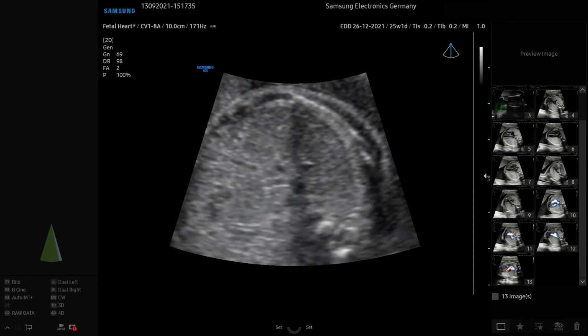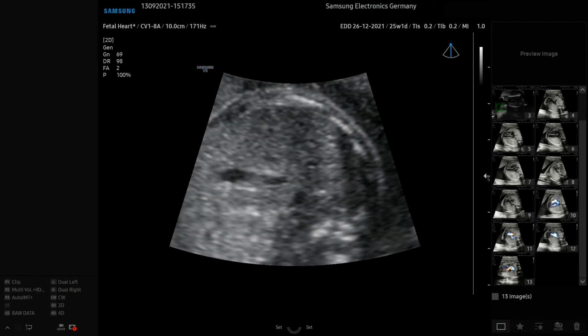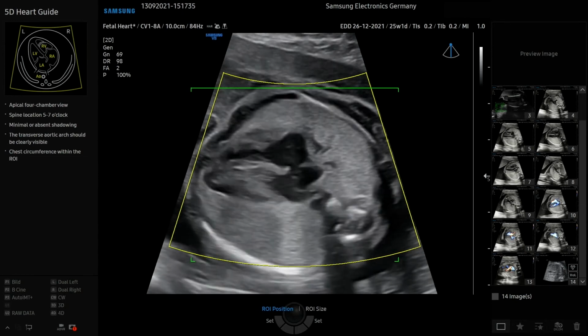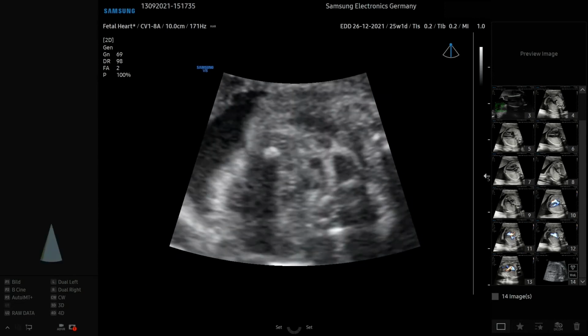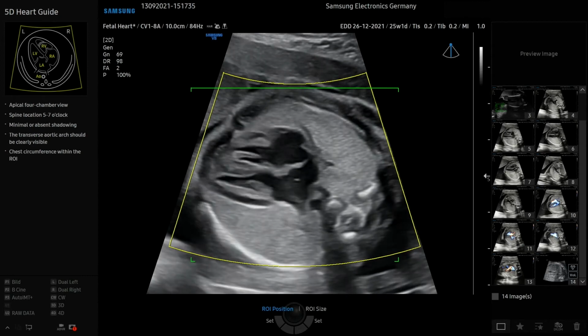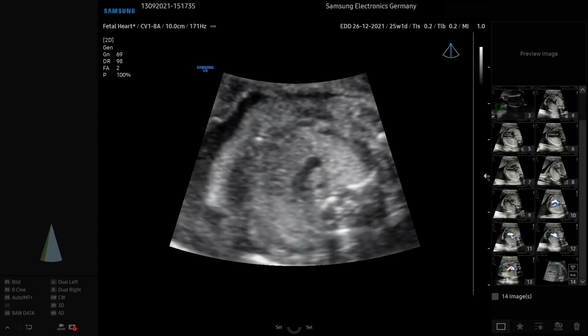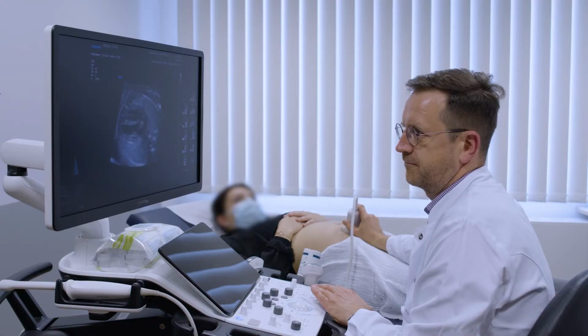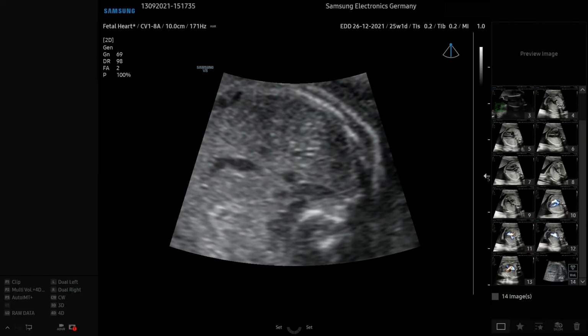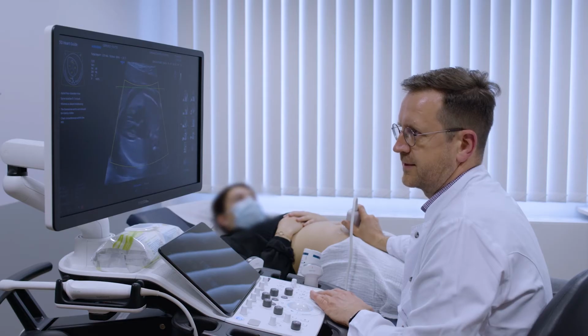The baby is a little bit moving. I save the volume, and I take another sample. And cancel because of the movement of the baby. Again, baby, be quiet. Excellent. So I save this volume again, and I'll show you the result immediately, but I will do another static volume, and I show you what it means.